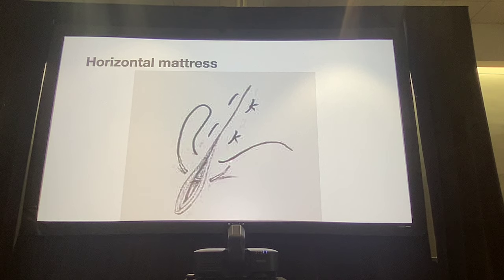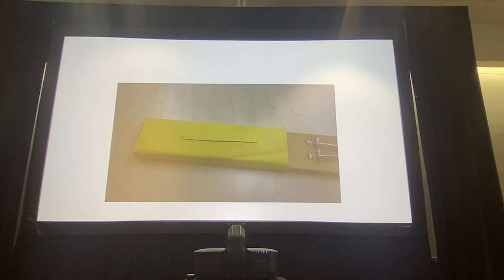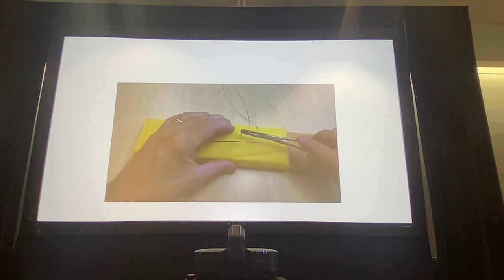You're inserting the needle on one side of the incision, coming across, and then looping, going back the other way. And then you're tying your knot on this side of the incision. So cross, loop around, and come back through the other way, and then tying it. And hopefully you'll be able to feel the tension that this suture pattern creates. Because it's going to pull the side of the incision opposite your knot towards the knot. It's gonna pull it forward.